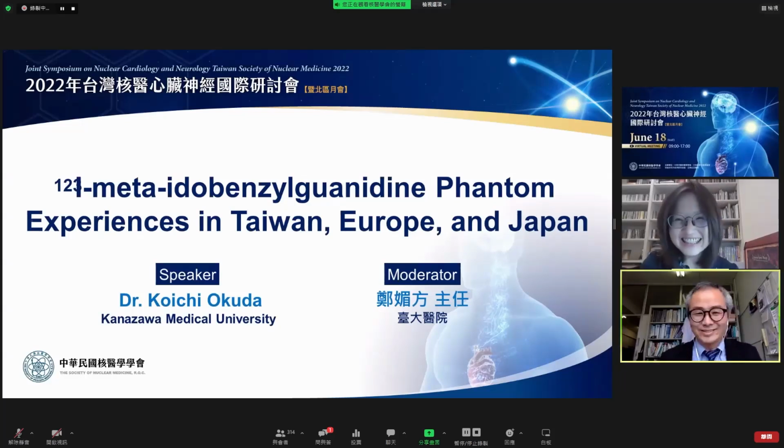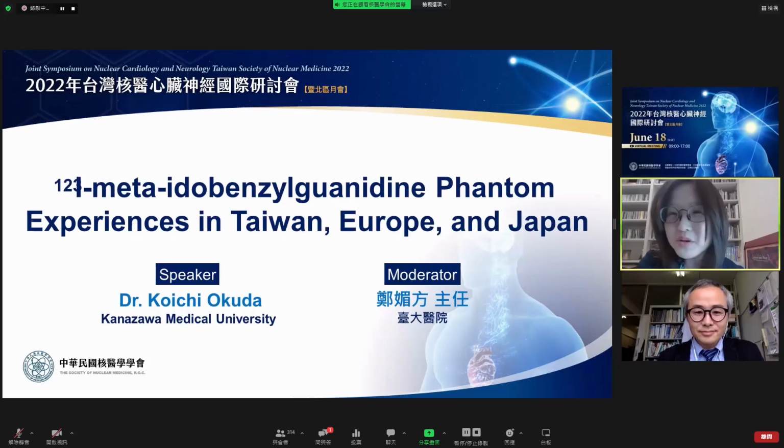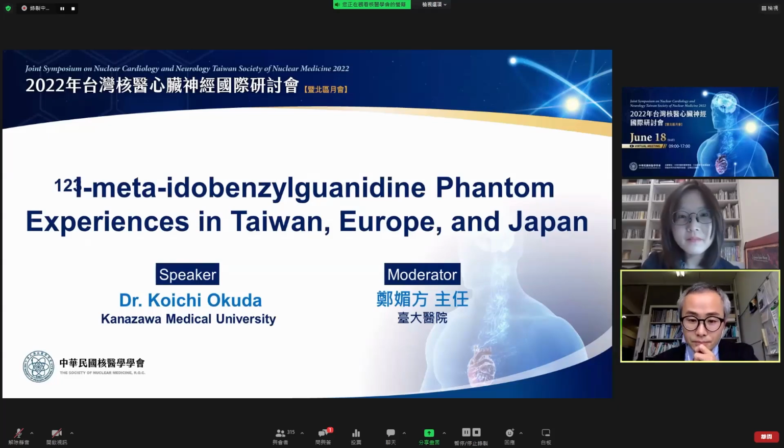Yes, for sure. We have one more question from the audience. Is a CZT detector, such as the CZT whole-body SPECT, more suitable for the iodine-123 MIBG scan? The CZT detector such as CZT whole-body SPECT can be suitable.